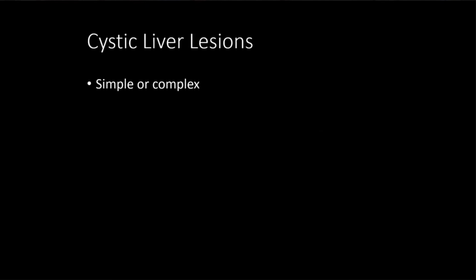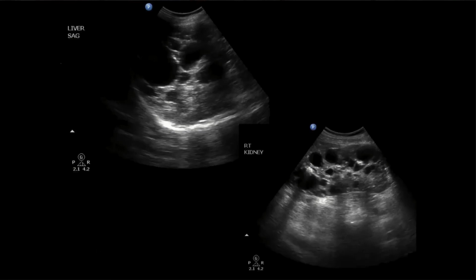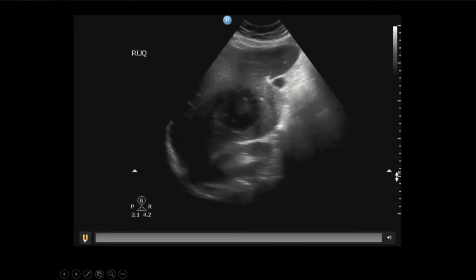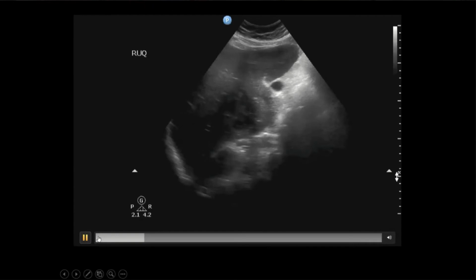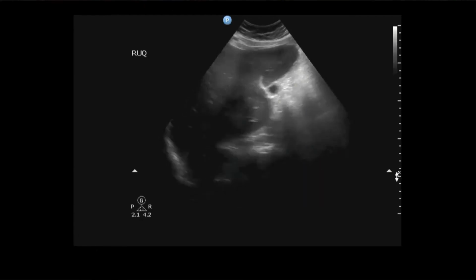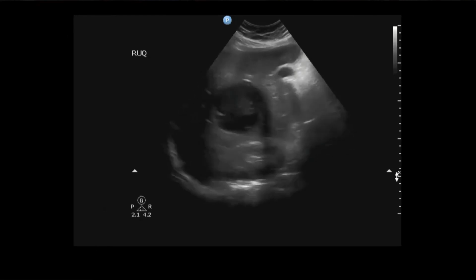So hey, Sandy, can you go back to that abscess right before the polycystic? When you do the sweep on that, it almost looks like in the periphery that there's multiple rounded cysts in the periphery. Was there any chance this was echinococcus and that those were like little cysts?